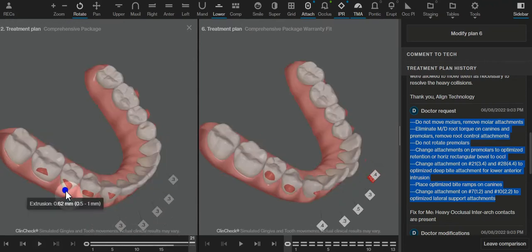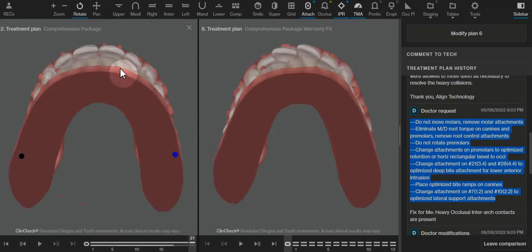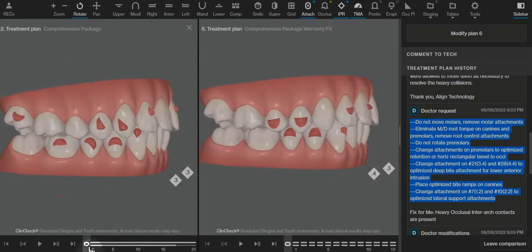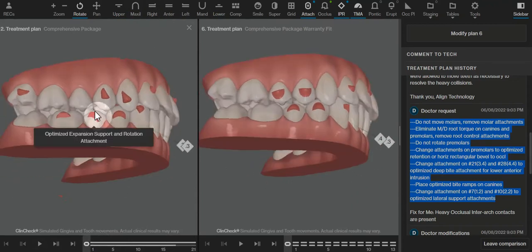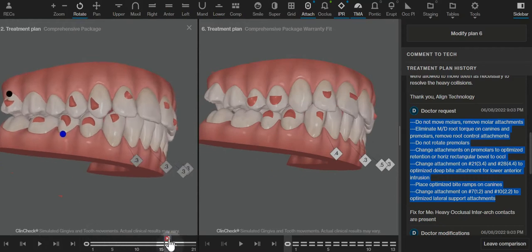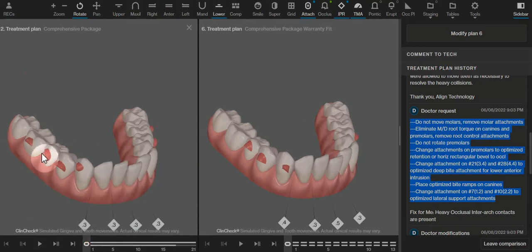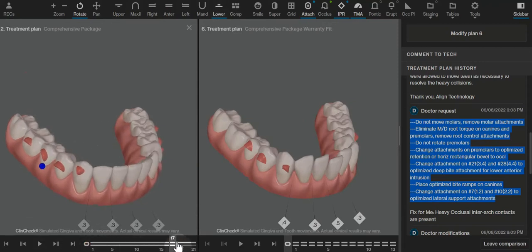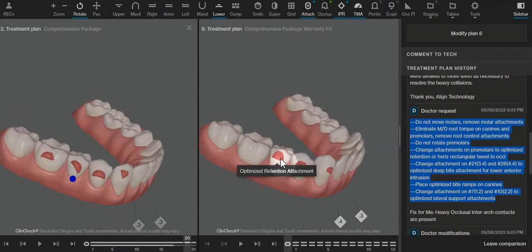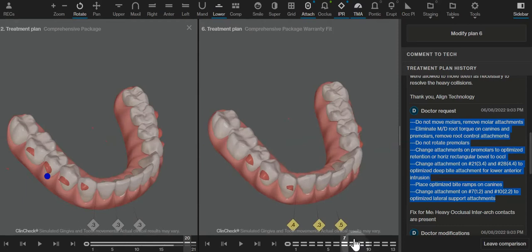I can see that this has an extrusion movement, and by the look of this attachment, there's also some rotation. So let's look at why that tooth might be extruding. It starts off without much of an occlusal point. But without the rotation, if we could just upright and tip the premolar to the buccal using crown tipping, then that's going to finish in a heavier occlusal position, and using a retention attachment like this can then hold on to the tooth better, where we can just do some very simple expansion movements.